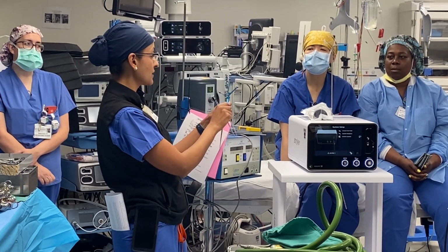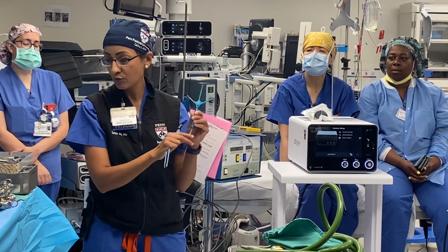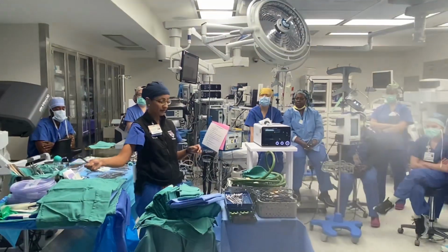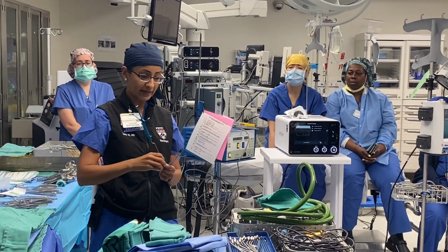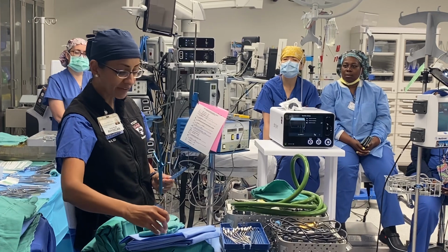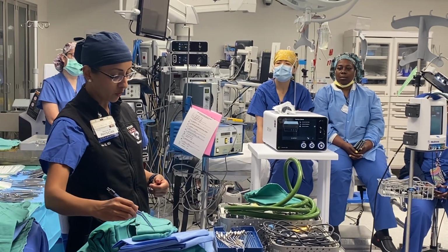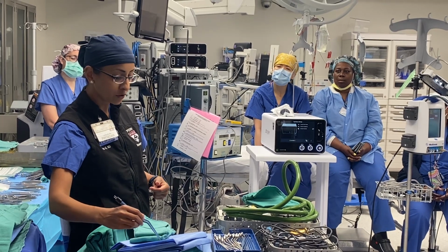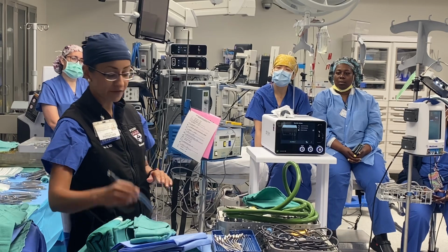So sometimes you'll see us mess with that. This thing we usually leave on the Mayo. We try to leave it protected. But we'll decide, okay, we've got to get to this particular part of the brain, and we're going to be navigating that. Once we're happy with that, we're going to do what's called a corticectomy, which includes using the bipolar to coagulate that surface of the brain.